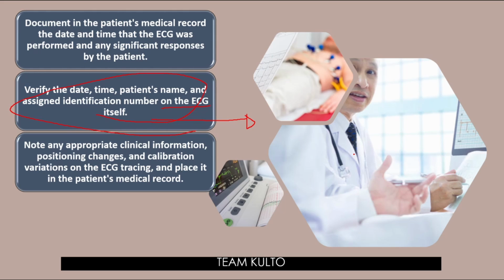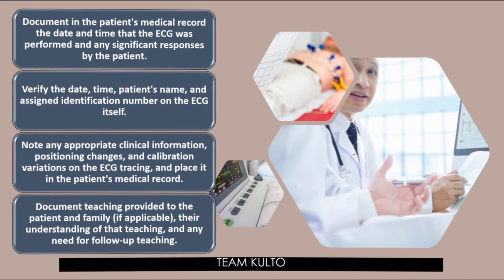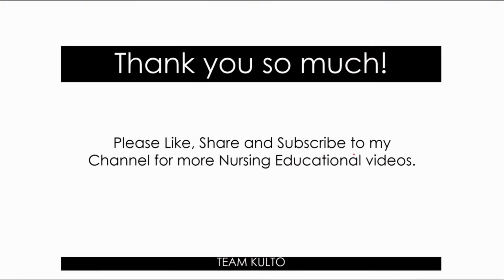Note any appropriate clinical information, positioning changes, and calibration variations on the ECG tracing and place it in the patient's medical record. Document teachings provided to the patient and family if applicable, their understanding of that teaching, and any need for follow-up teaching. Alright, so yun na nga, doon na nga natatapos ang ating lecture for today.